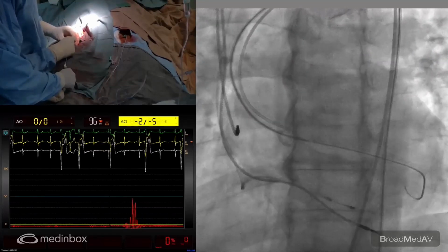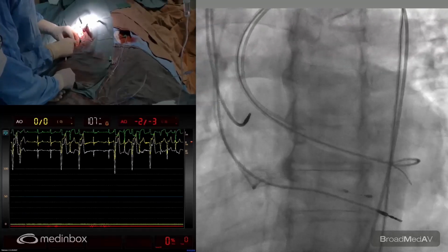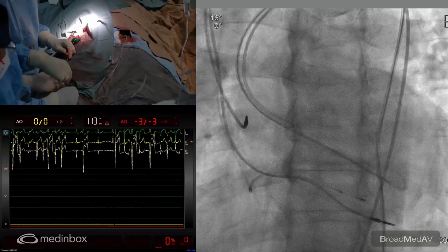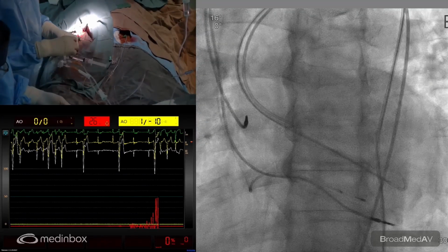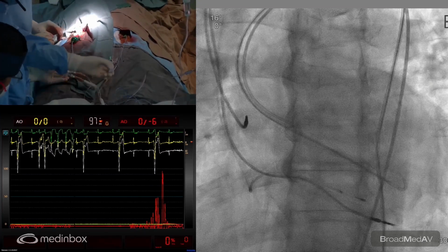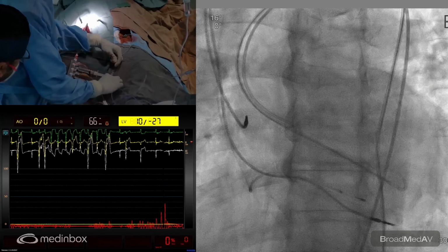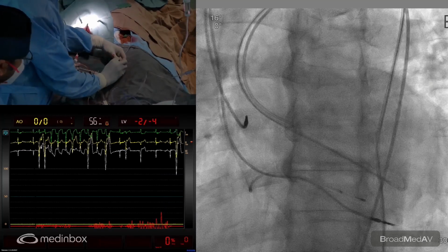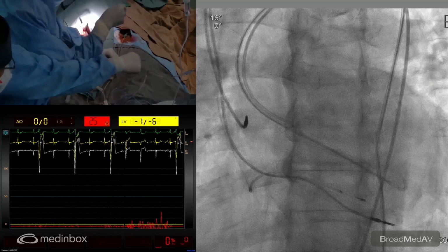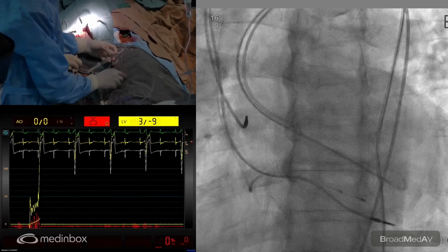Okay, the Safari wire and the balloon to be ready now after the Safari goes in. Wire back. We'll do some hemodynamics. So we're right at the apex of the left ventricle, and we're going to give you some pressures there. Disconnect this and connect the pressure. High pressure, you can connect the pigtail to the injector on the other side. Can we have the pressure on here, the left ventricular pressure? Prabhu, LV pressure, please. It's on. Both the pressures.